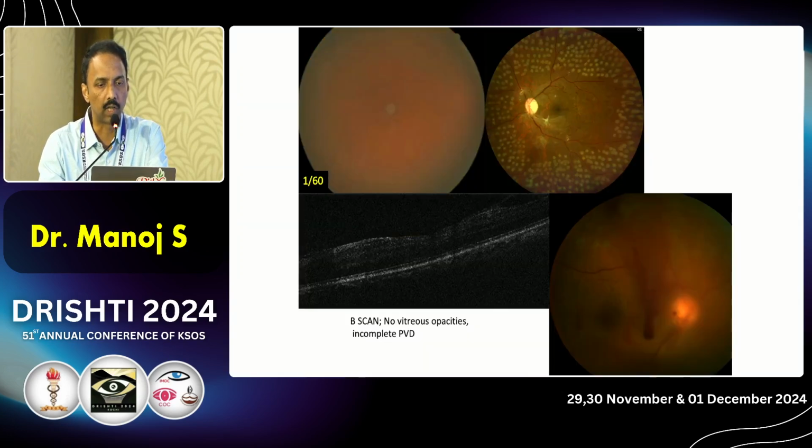And this is another scenario here. Patient with PDR managed with photocoagulation. One eye had a cataract. OCT showed a near normal looking fovea. And 3 weeks after the cataract surgery, patient came with further drop in vision. There was a vitreous hemorrhage in spite of a normal ultrasound preoperatively.